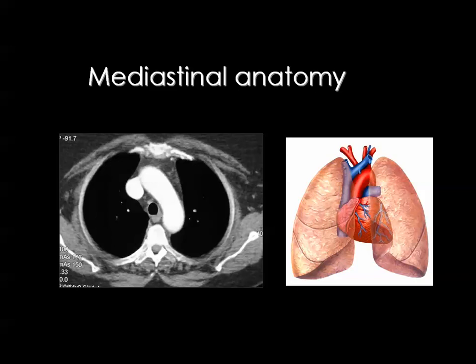Moving to chest anatomy: we have two image types — mediastinal images and lung images. In mediastinal images we identify mediastinal structures; in lung images we identify the lobes and segments of each lobe. To interpret chest CT scans you must identify our anatomic landmark — the arch of the aorta — which chest physicians commonly call 'the banana' for its resemblance to that shape.